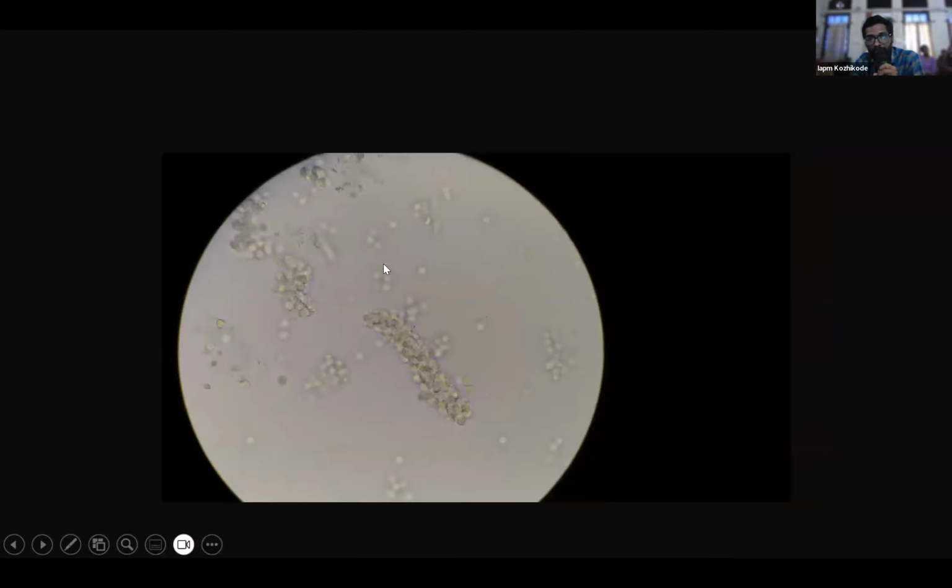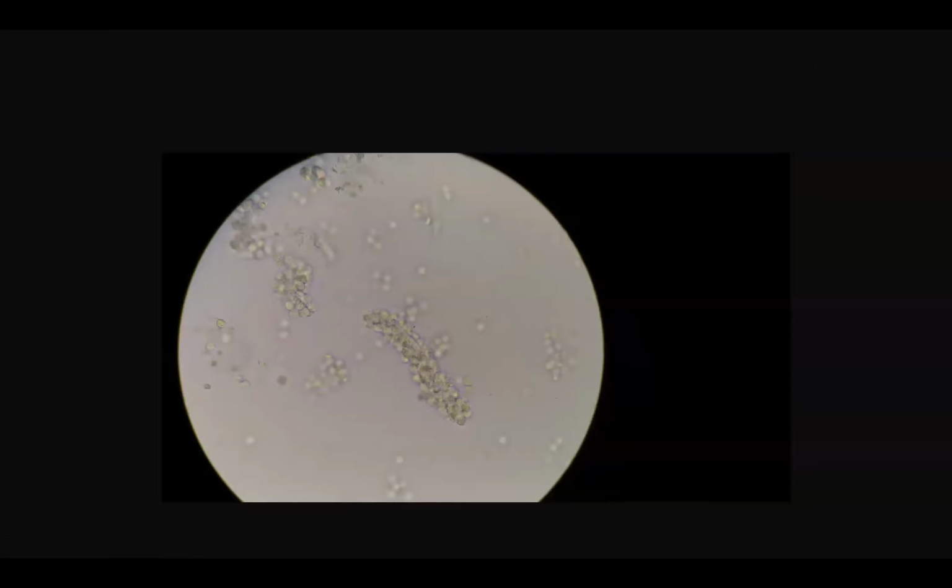I think it is important because, let us see this microscopy. What do you think this cast is? You are clearly seeing cellular outlines. Yes, this is a cellular cast. And what is in the background? A lot of WBCs. So what is the diagnosis? There is only one diagnosis: acute pyelonephritis. I cannot have a cellular cast like this containing a lot of WBCs from anywhere other than the kidney. I cannot explain this otherwise.